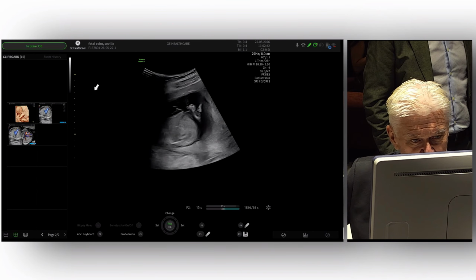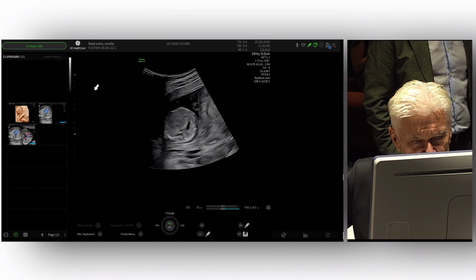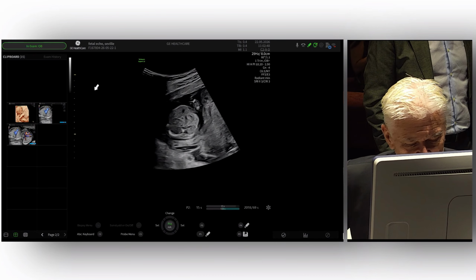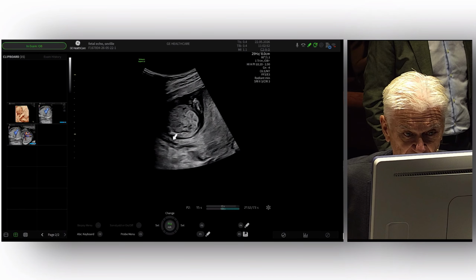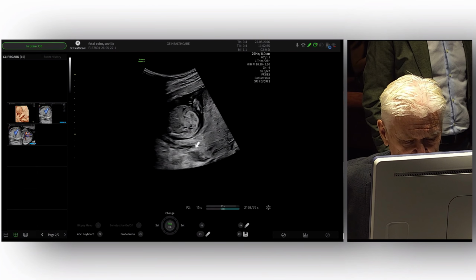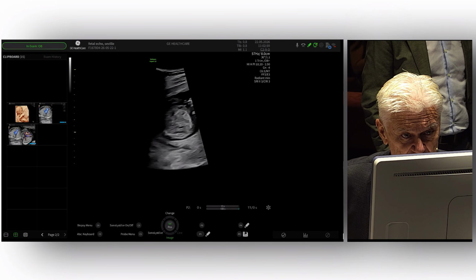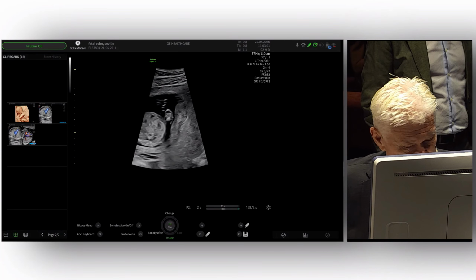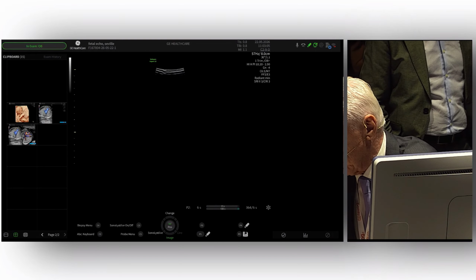I then bring my probe around to make the spine in a 6 o'clock position. The next step is, you'll see I'm running at around 29 hertz. What I do next is I reduce my sector width, and that goes up to 57 hertz. I might just have a little bit more gel. Just hold on for a second. Just drying up on gel.